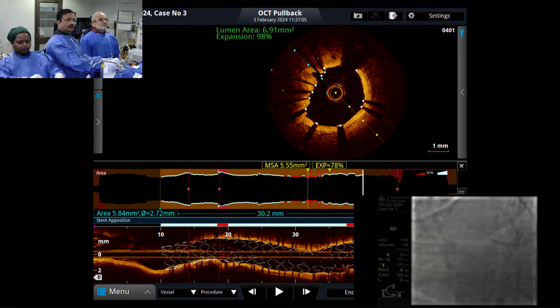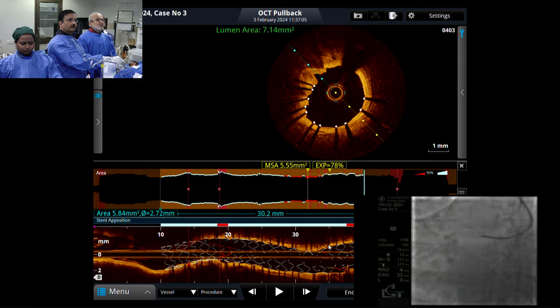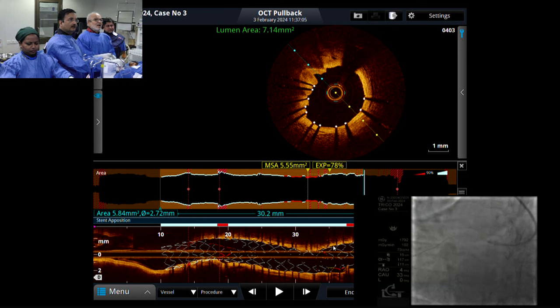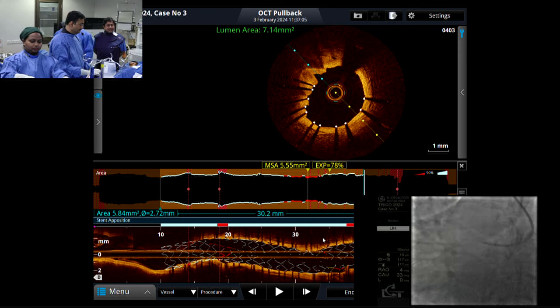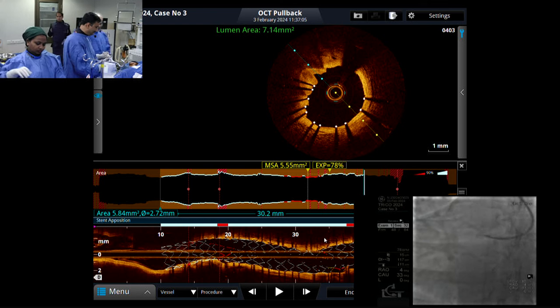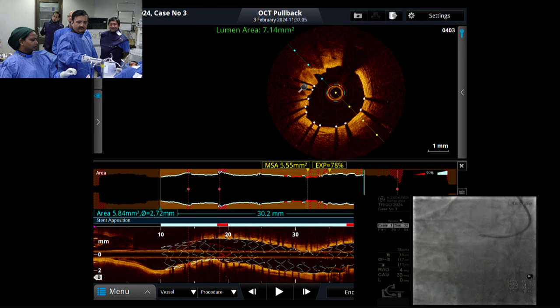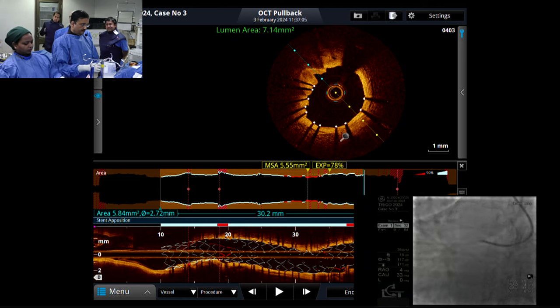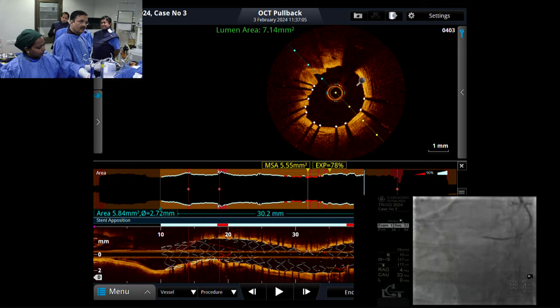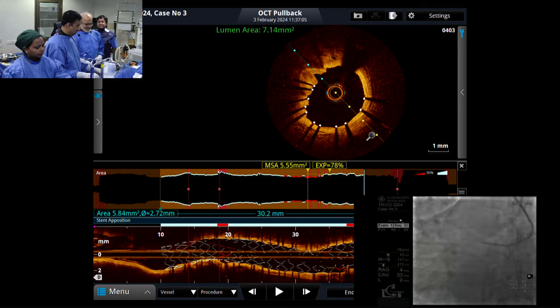Okay. I'm wondering, here is an eccentricity. Look at the curve. Look at this curve and see my wire movement now. And I am in. Now we will see the OCT. Again, Dr. Patel said the calcium is here, very eccentric, thick calcium, and the opposite side is nearly normal. Yes. If we dilate using a bigger balloon, higher pressure, we may have a chance to rupture. Yes. Absolutely.